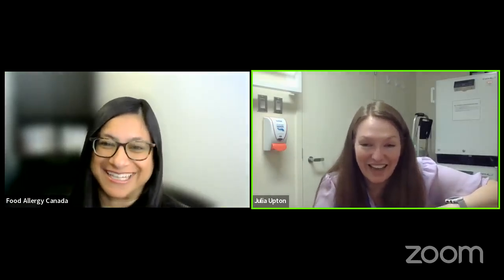And then I think the other part of the question was, if it's expired, let's say, 6 months, is it still good to use? What time frame is it like, no, just don't use it, it's too far gone? I'd probably still use it if it's the one I have. Okay. But ideally you get a new one.